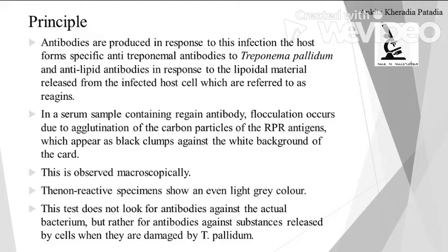This is observed macroscopically, which means you can observe this flocculation or precipitation by the naked eye.